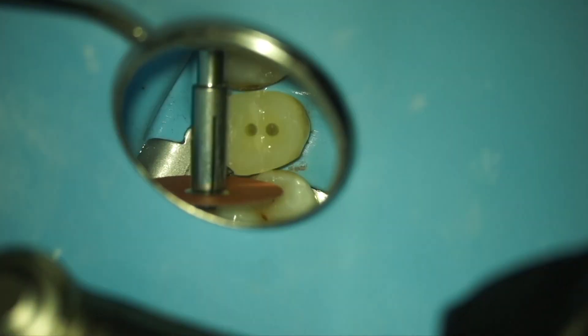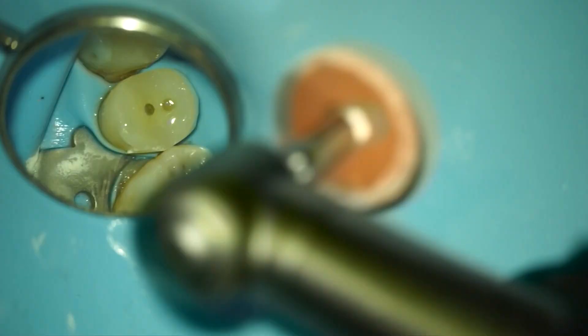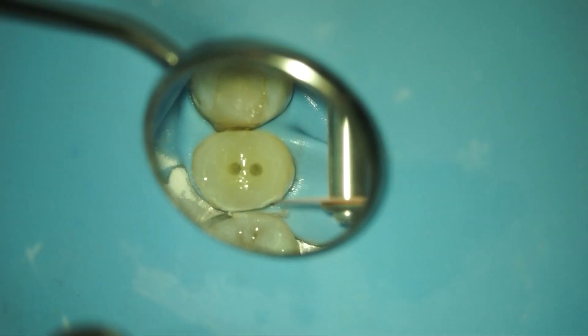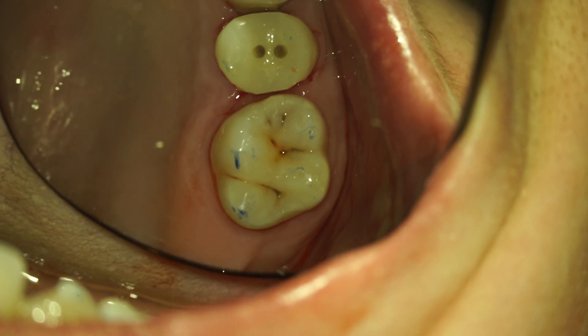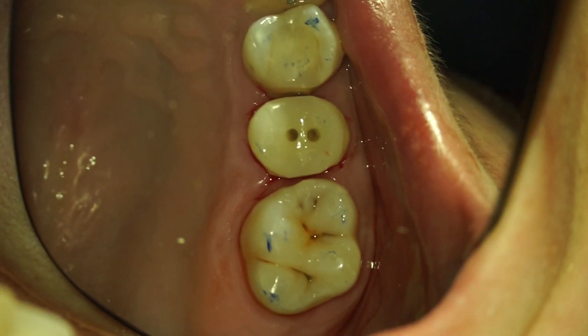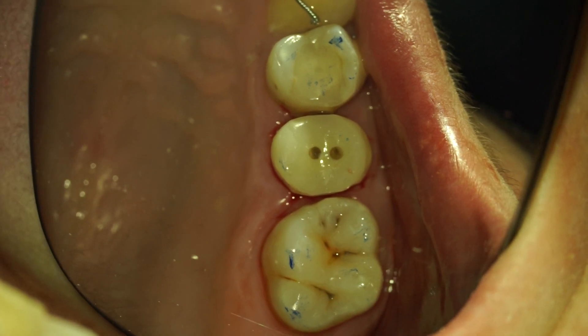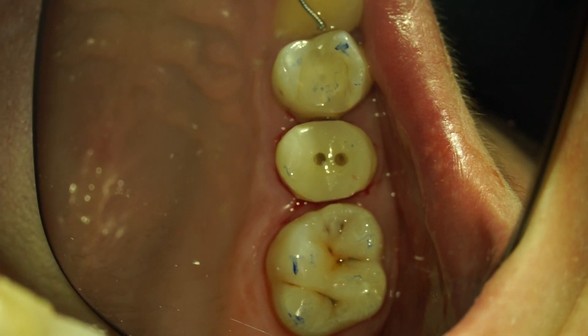After the build-up is cured, it's time to finish and polish. In this case I used the Softlex system and the Pogo polishing system. Then it's time to remove the rubber dam. Here you can see the final result — the tooth has a build-up, the posts are in place, everything is polished, and it's ready to receive a crown.